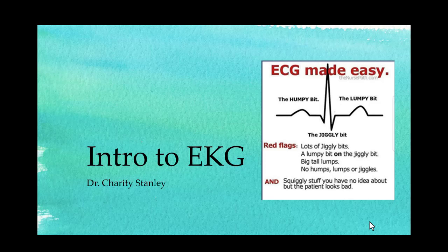So I found this meme, EKG Made Easy, the humpy bit. The humpy bit is the PR interval. It's the P wave where the complex is started at the SA node, then goes through the QRS or the jiggly bit. And then the lumpy bit is where it's all getting ready to happen again. That's the T wave. So, things to look out for, squiggly stuff you have no idea about, but the patient looks really bad. And yes, that's definitely something to watch out for.